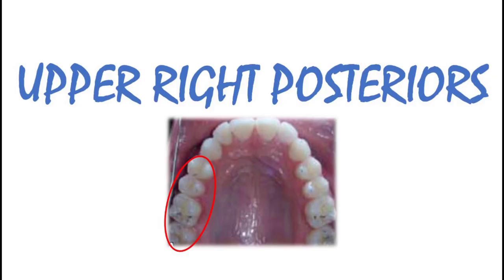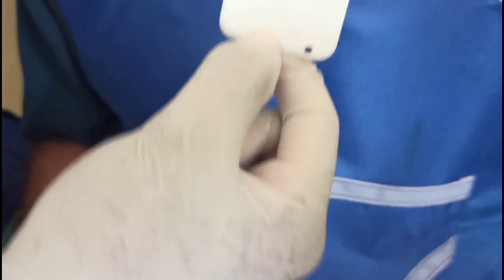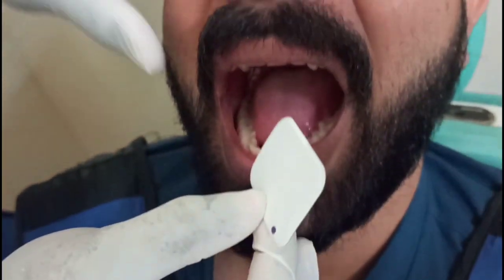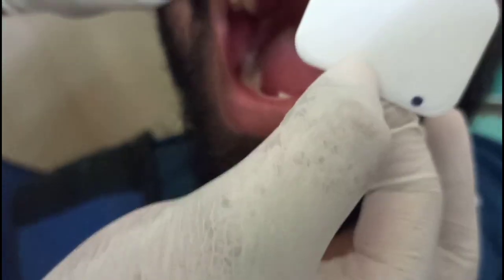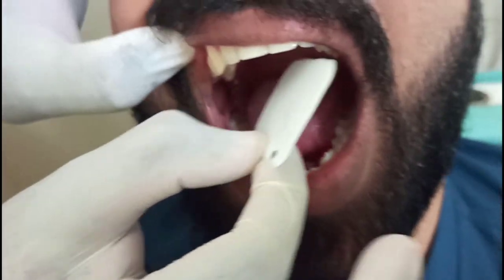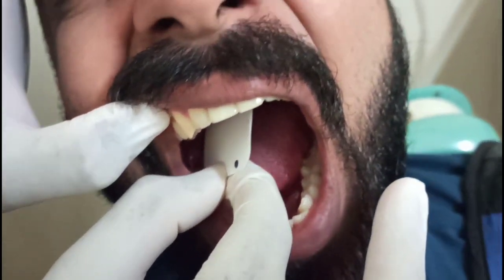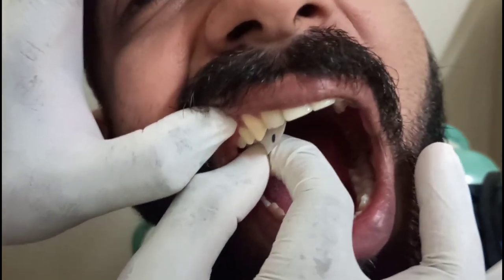Placing the film for upper right posteriors: similarly place the thumb finger and hit the thumbnail to the occlusal plane, making sure that the edge of the film is parallel to the occlusal plane, and ask the patient to hold it with his index finger.